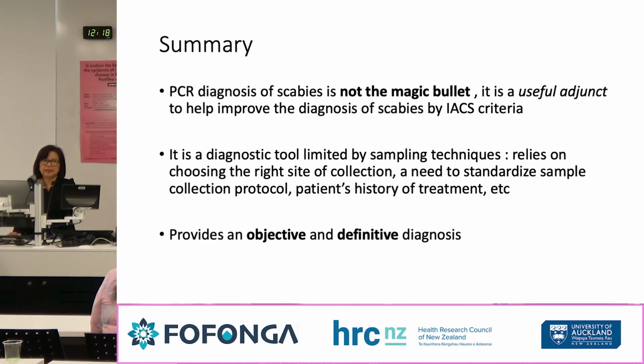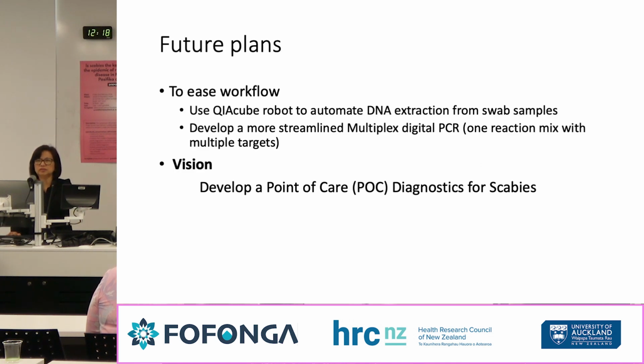So to summarize, I'm not giving Simon and Gerard a magic bullet, but I'm giving them a useful adjunct to help improve the diagnosis of scabies, which is really objective and definitive. But as I would always say, the tools, no matter how high technology they are, will still rely on your choosing the right site where you collect the samples and some standardization, and you also have to look at the patient's history, and all that really contributes to the positivity or negativity of results.